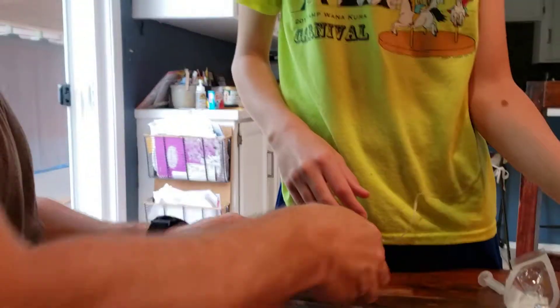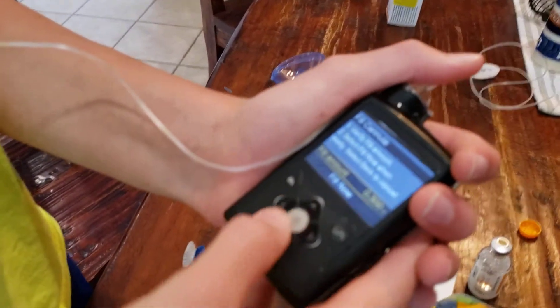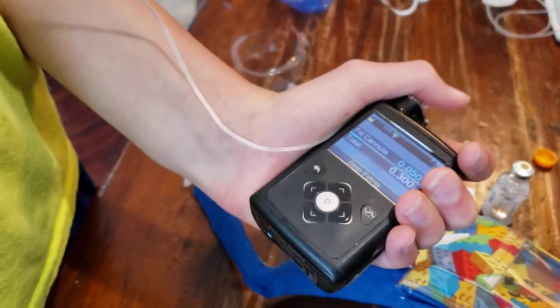Brown Snoopy has control of the camera, so I'm going to take that back. So next, Aiden, now you have to hit fill and it will fill — you don't have to hold this down, it's just filling. What does it feel like as it goes into your arm? Nothing. I don't feel anything.